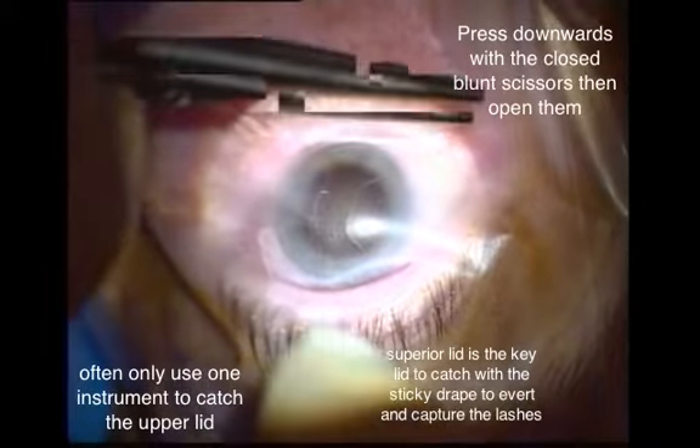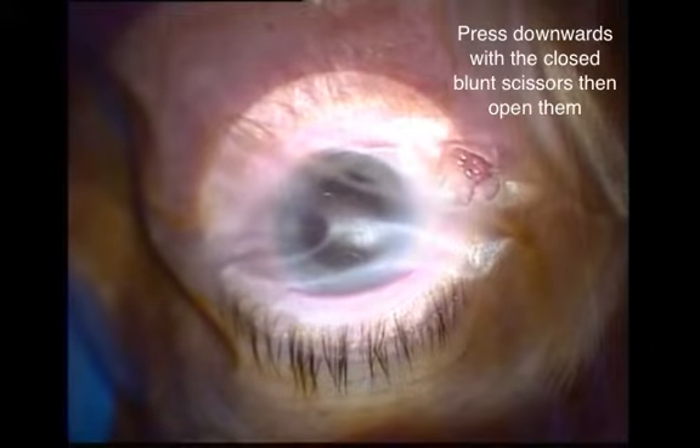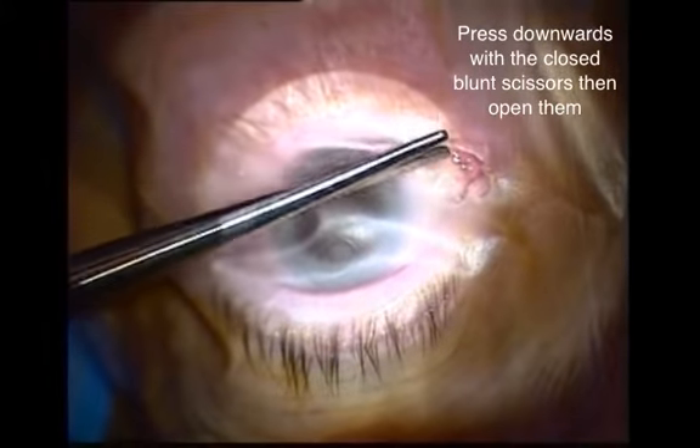Open the eyelids as wide as possible. Sometimes one can use cotton-tipped applicators to help spread the lids apart, and then catch the lids with the drape.